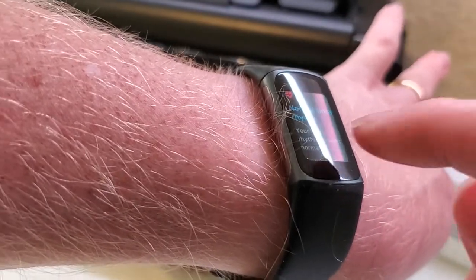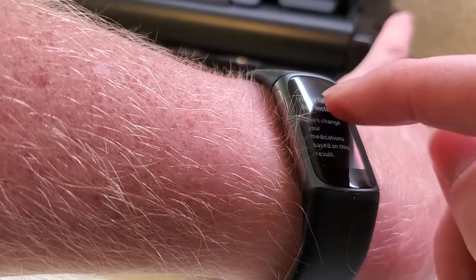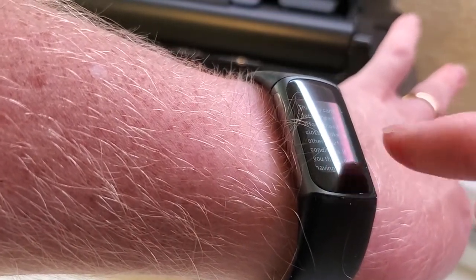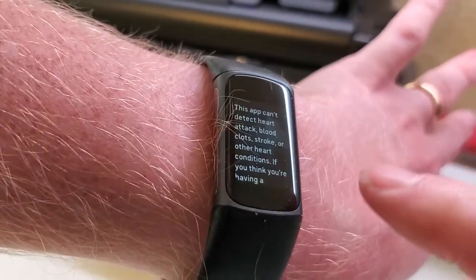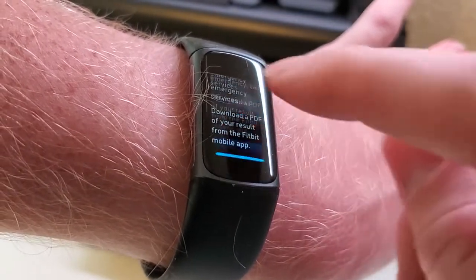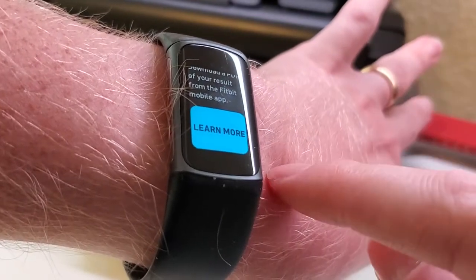A couple of things that Fitbit notes: your heart rhythm appears normal, but if you're not feeling well you should talk to your doctor. Don't change medications based on the result. Also, arrhythmias do not mean a heart attack, a stroke, or blood clots — there are plenty of things it can't detect. So again, if you think you have any kind of a problem, contact emergency services right away and contact your doctor as well.